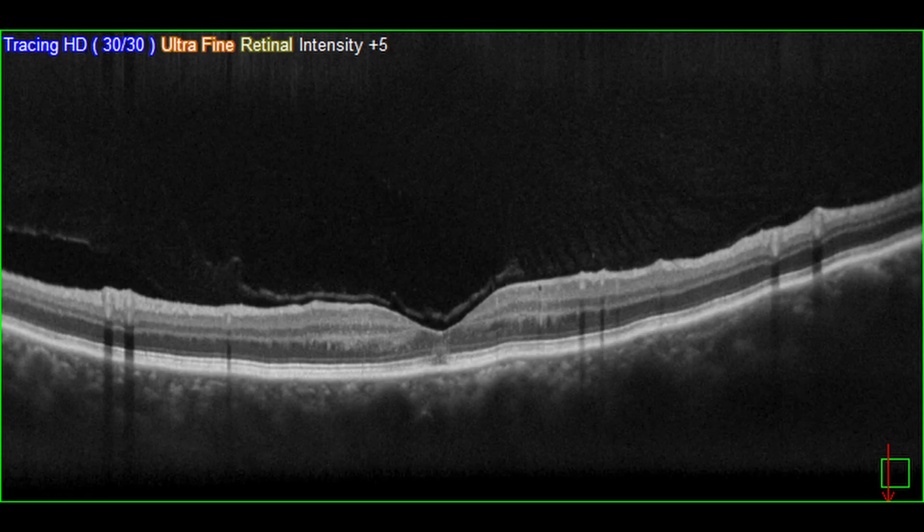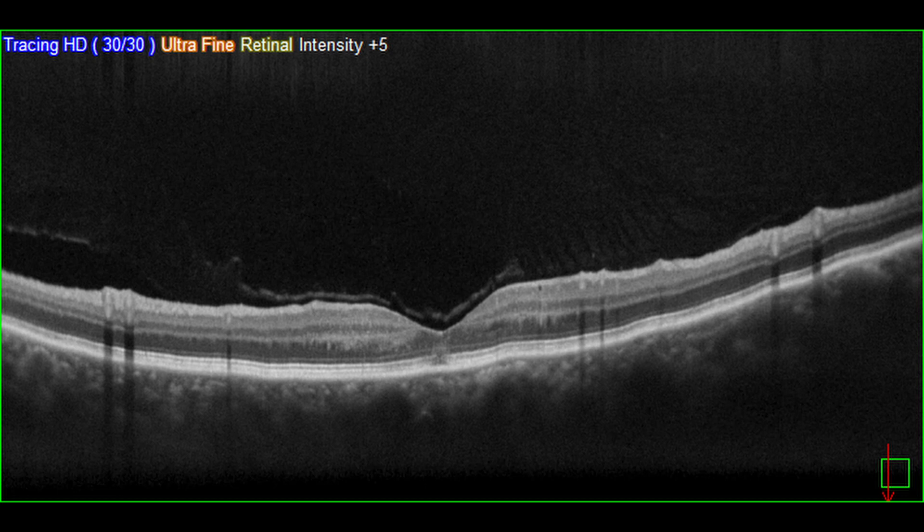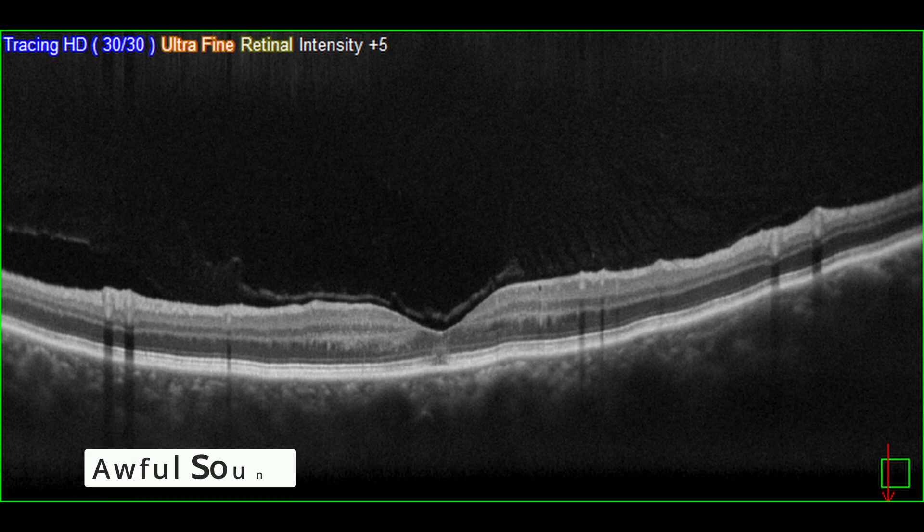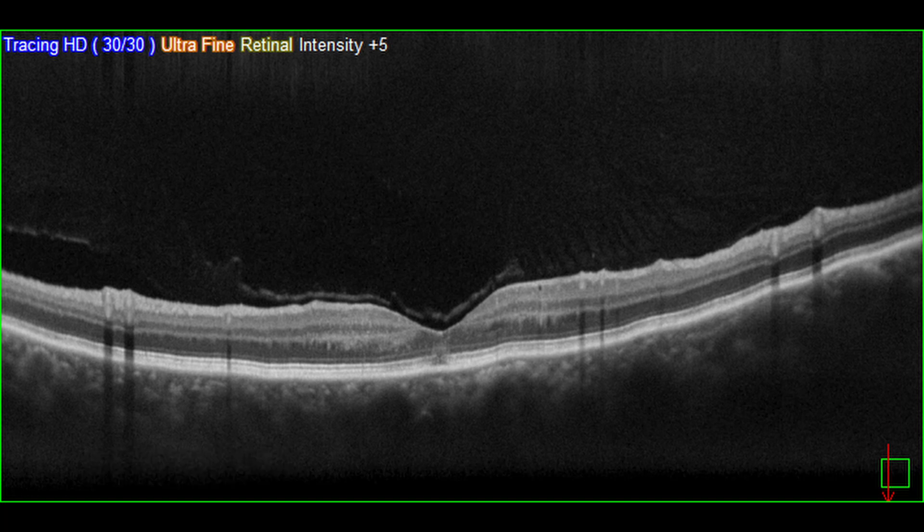What I don't like about this machine, well firstly the sound. There is this laser, the polygonal scanner that's inside the machine that can make the operator insane. It's really high pitch.